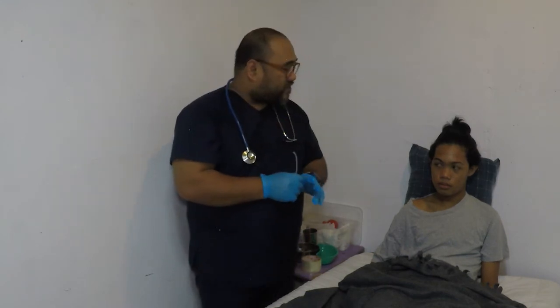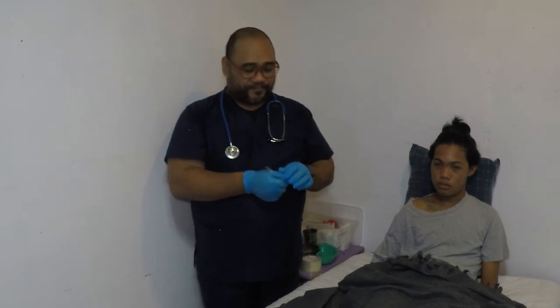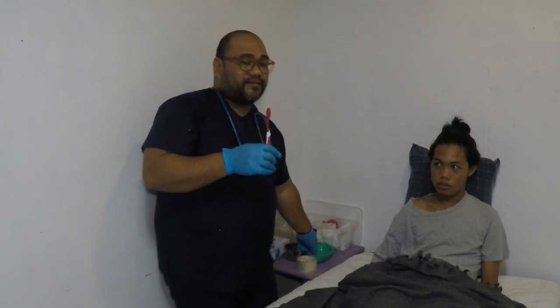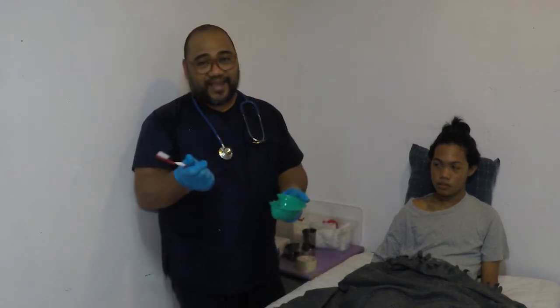When you check the face of our client, make sure that there is no tape or any residue of the tape on the skin. So if there is any, acetone can help remove any adhesive substance from the face. You should also wipe acetone off after removing tape because it can cause skin irritation. Then we also have to provide mouth care if needed for the comfort. So we already did that after we fed the client.